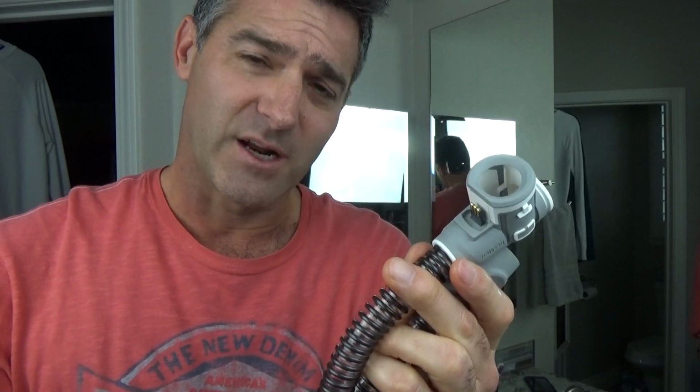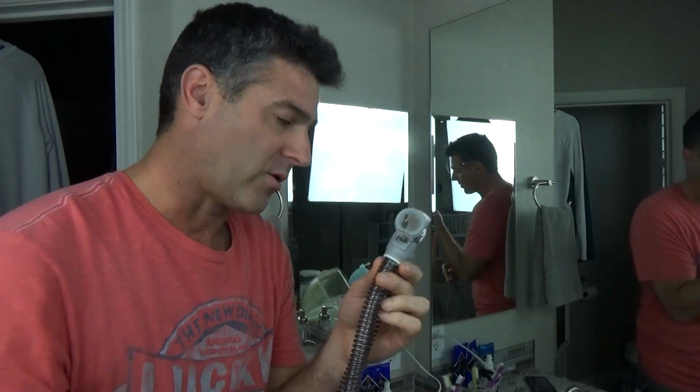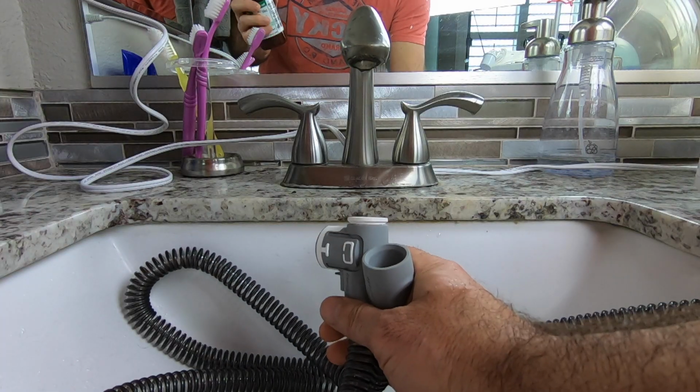Now you can get that wet, that's not a problem. You just wanna make sure it's completely dry before you start using it. So we're gonna go ahead and get that wet right now. Now one question I get a lot of is, how do I get that inside of the tubing?